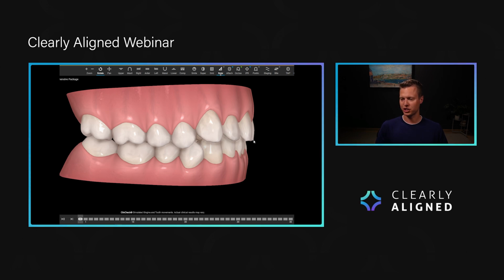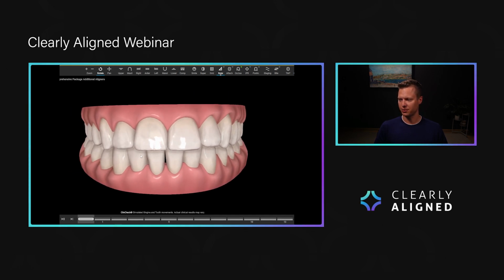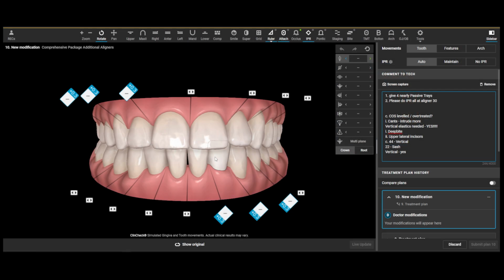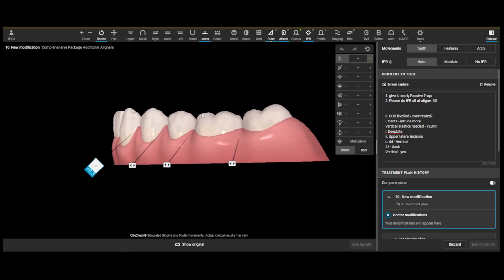Now again, unfortunately, I can't just click the modify plan on this plan. I have to do it on a different one. So I'm just gonna actually go to treatment plan number 9, which is like their completed treatment plan when everything is all said and done. I'm gonna click modify on that. You guys missed that because I'm not showing the full screen. But I clicked modify on the top right, and now it'll let me go ahead and make some changes. So I'm just gonna show you real quick how you take control of this using 3D controls yourself.